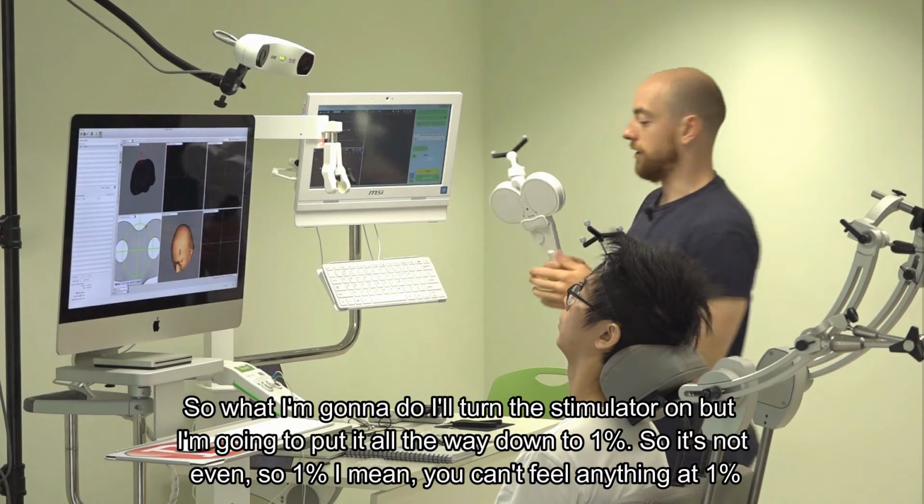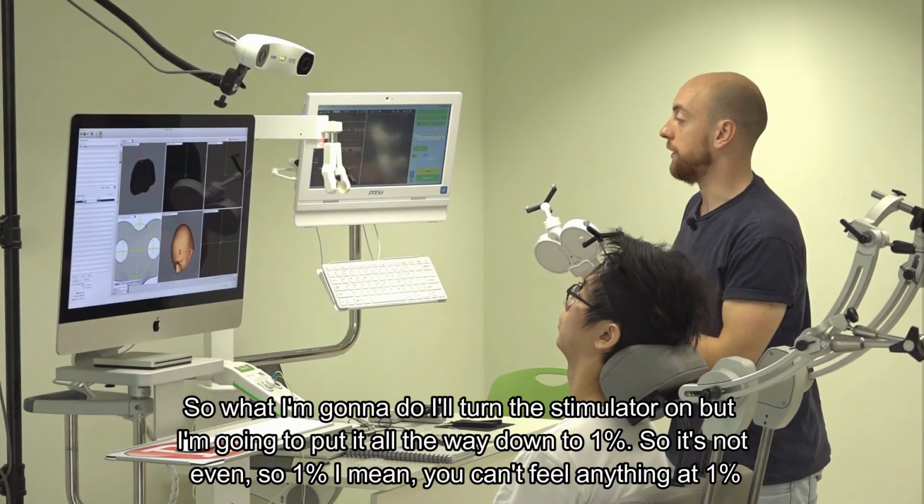So what I'm going to do, I'll turn the stimulator on, but I'm going to put it all the way down to 1%.